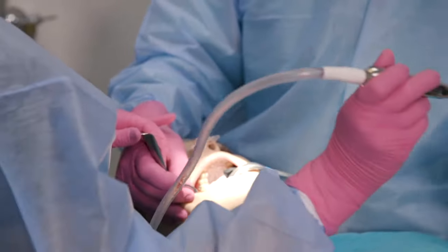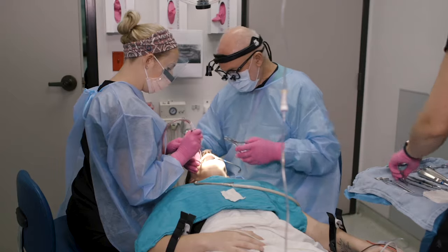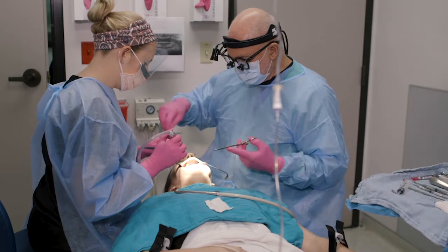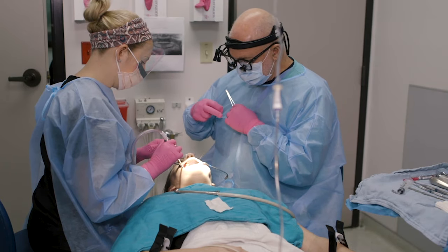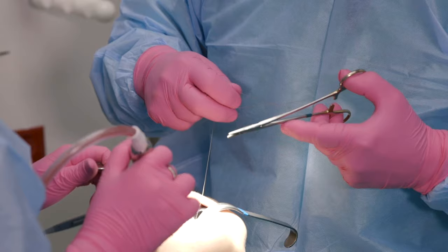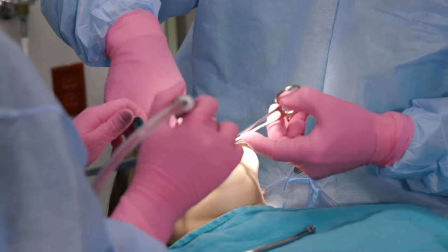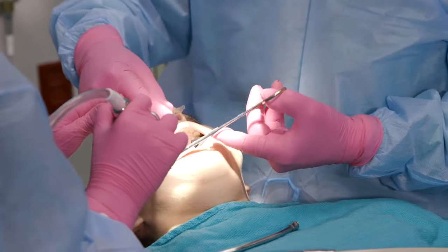It seemed like once you separated from the bone it almost popped out. Once you remove the bone that's impeding it, it comes out pretty easily. This is a suture material — a stitch material called plain gut — and it dissolves in about three to five days.